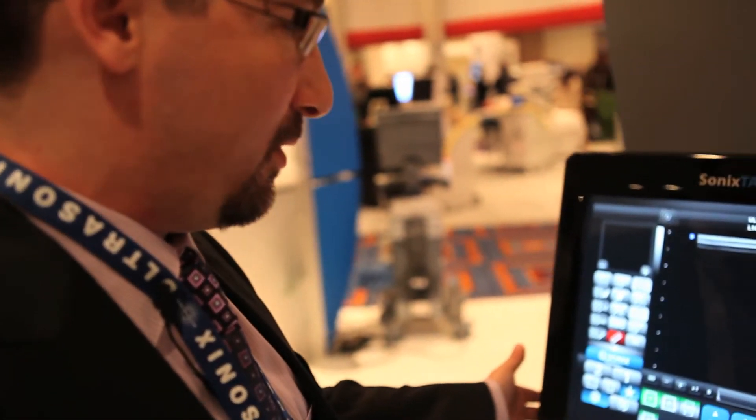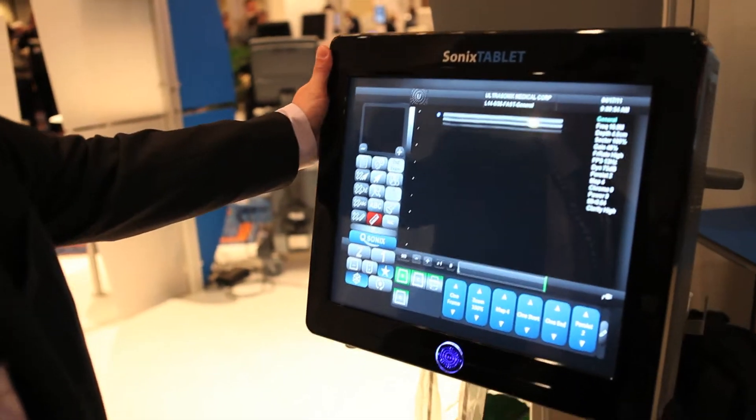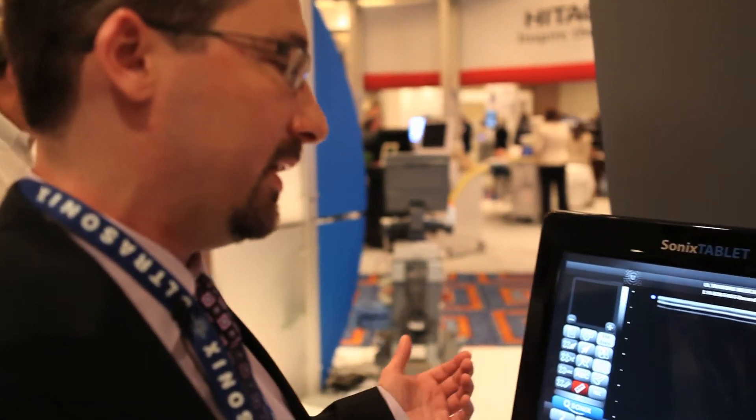This is the Sonics tablet ultrasound system — the latest product in the ultrasonic line. For customers who want all the same imaging performance benefits they get from the Sonics touch, they can still have those same powerful imaging capabilities in the Sonics tablet, but in a smaller form factor.